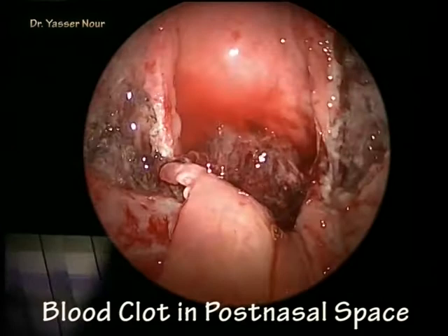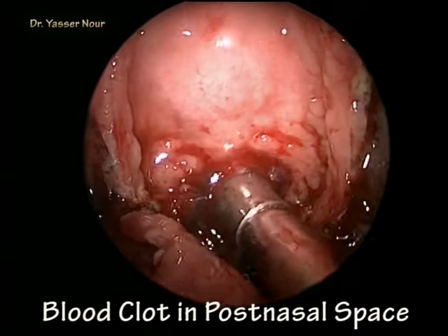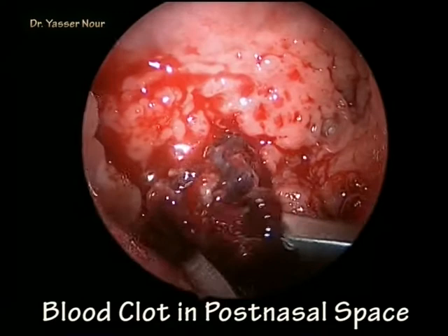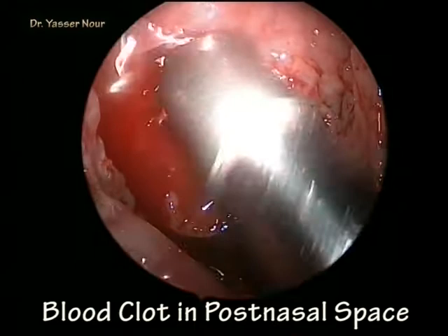As we can see here, there is a large blood clot within the post-nasal space. Using rigid suction, the blood clot was removed and we can see active oozing from the remnant of the adenoid. The curved forceps was used to remove the remnant of the blood clot, and you can see the adenoid remnant with active oozing.